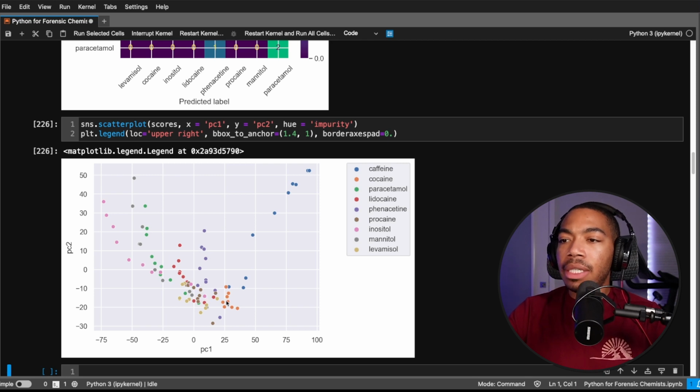And if you look at it, you can see that we have our orange samples that sort of interfere here. If you look at our orange and purple, they do sort of fall along this vertical line where we can almost imagine with a model that's estimating some coefficients that it could potentially misclassify, especially these 2 points here, if the PCA is giving us anything around the chemical similarity.